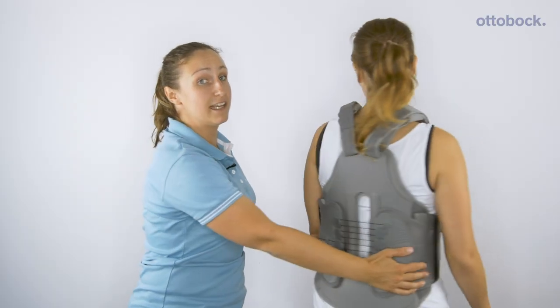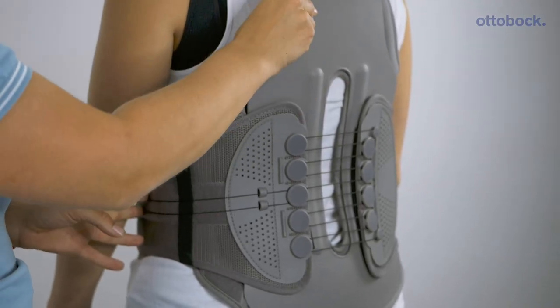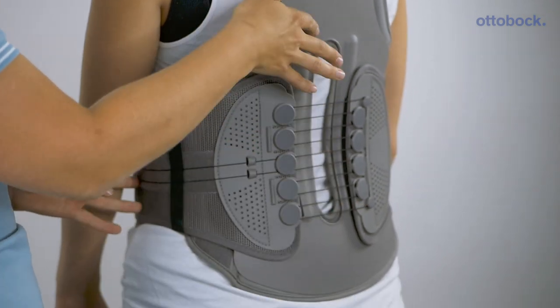The TLSO, hyper extension, and LSO range feature a heat moldable back section and also a cut out for the spinous processes.